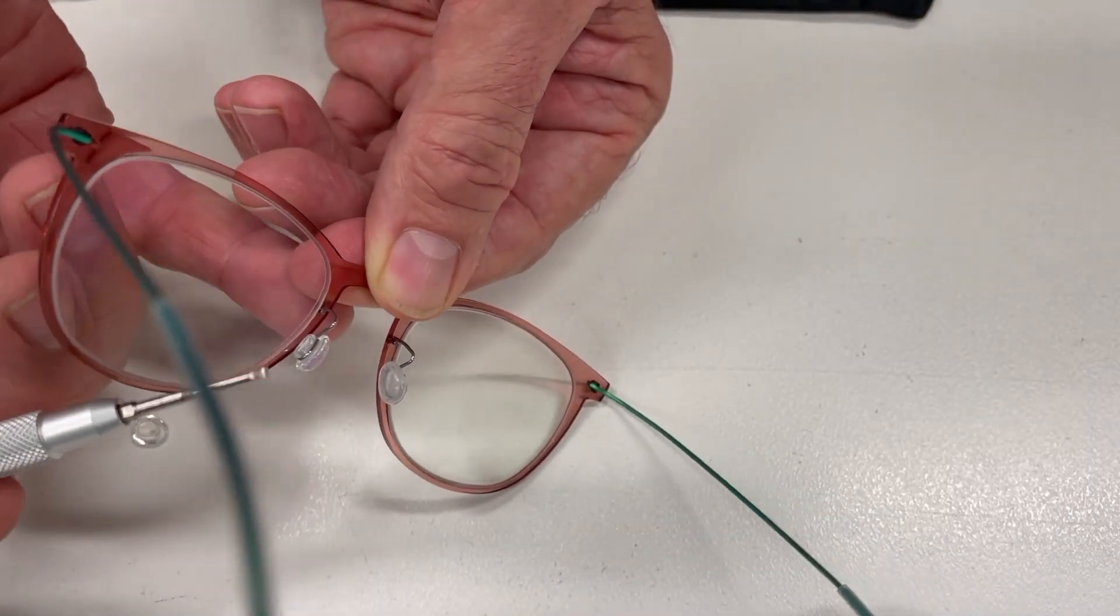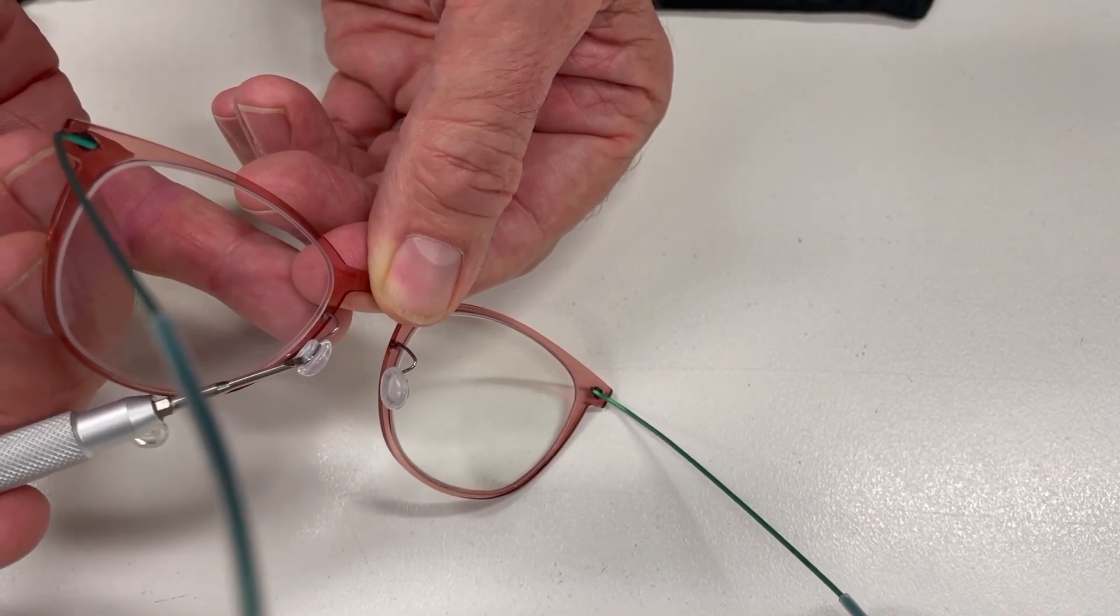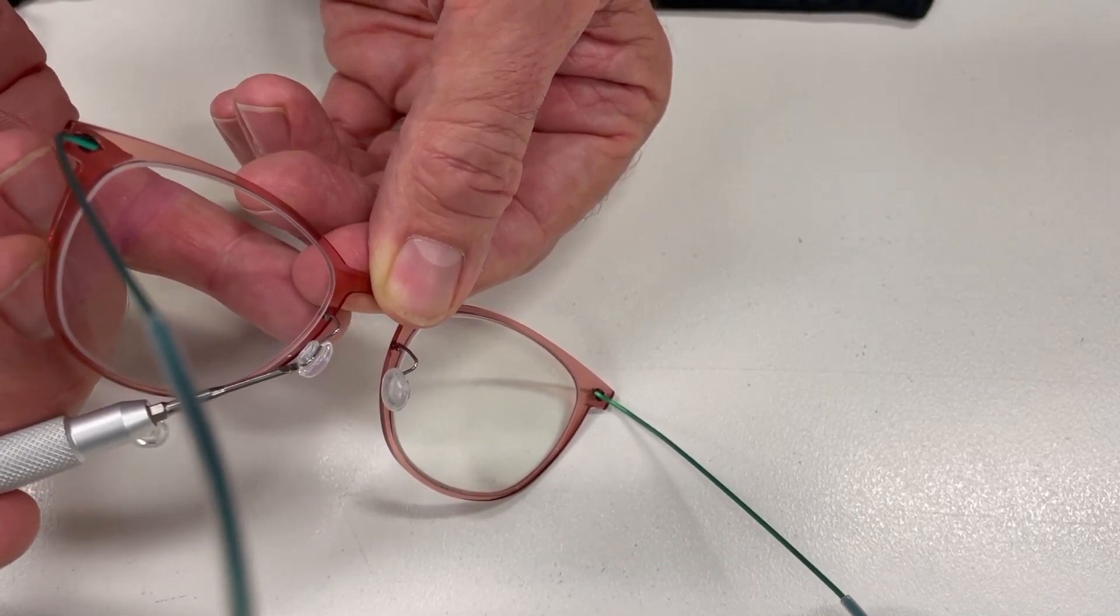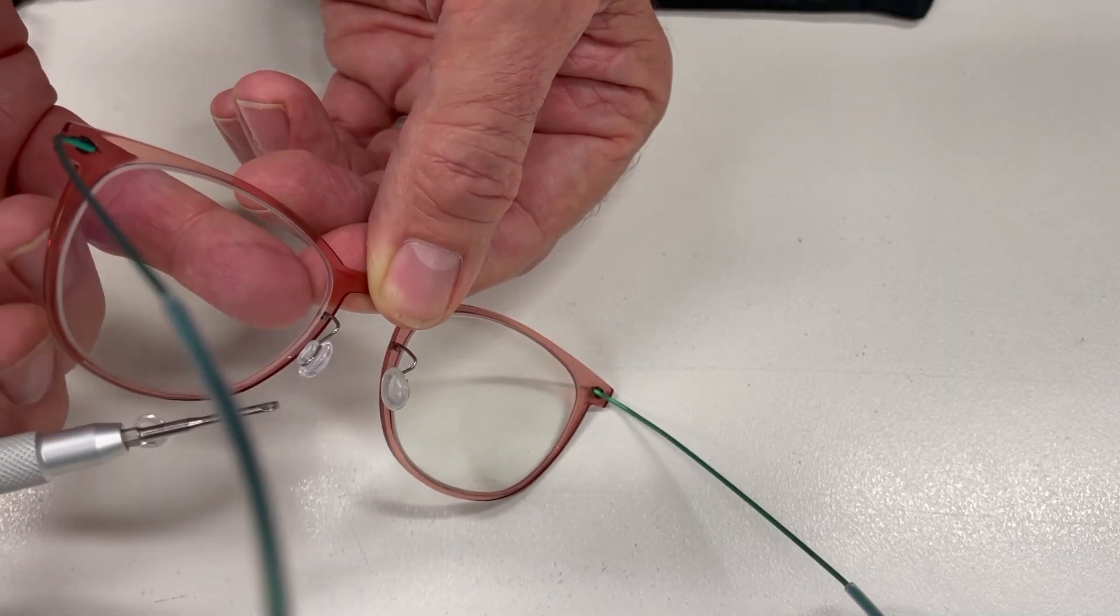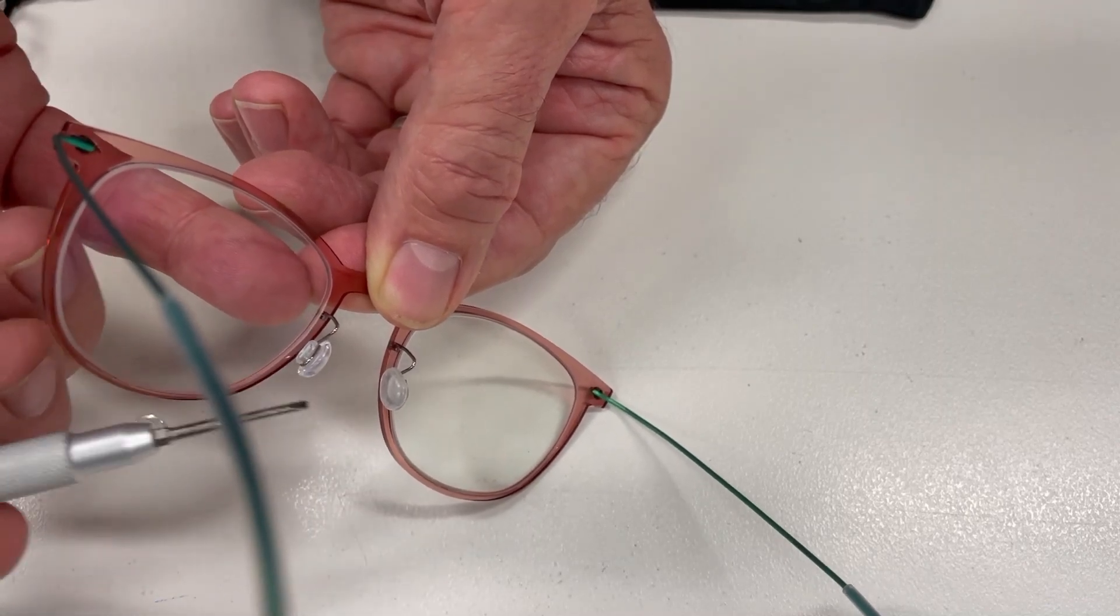Hey guys, Michael here from Visionary Parts. You can see this is a Lindbergh nose pad. They're a 7mm teardrop made out of silicon with a hard backing, and they sit in their little wire clamp.